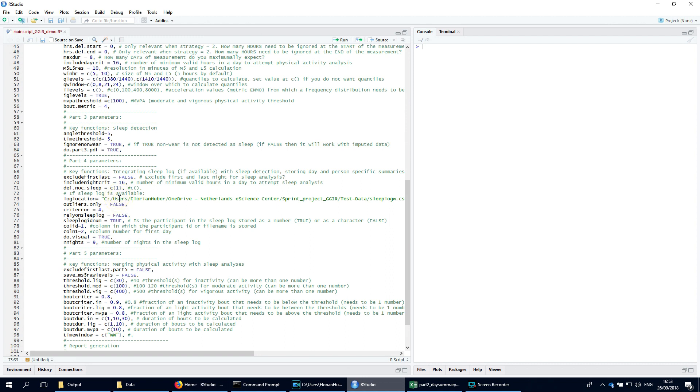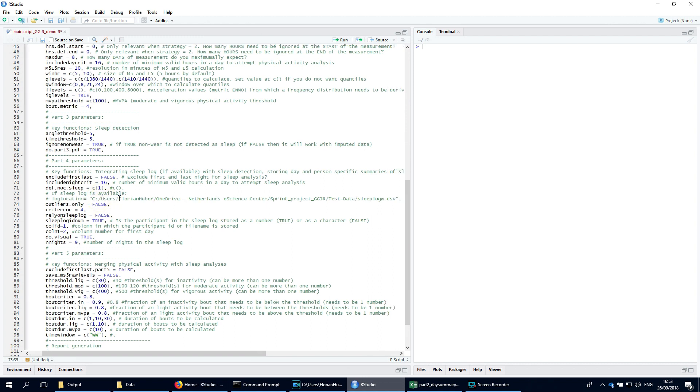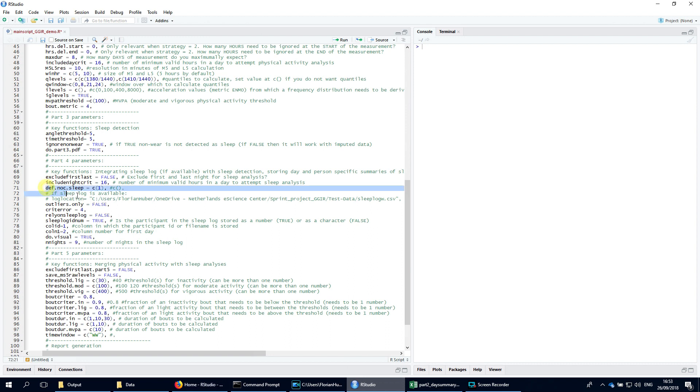If you do not have a log location, you should comment this out or just leave it blank, and then the code will automatically try to detect when the sleep period time window occurs. By specifying the argument def.noc.sleep, like I do here, you will make sure that GGIR uses the latest algorithm for sleep period time window detection.